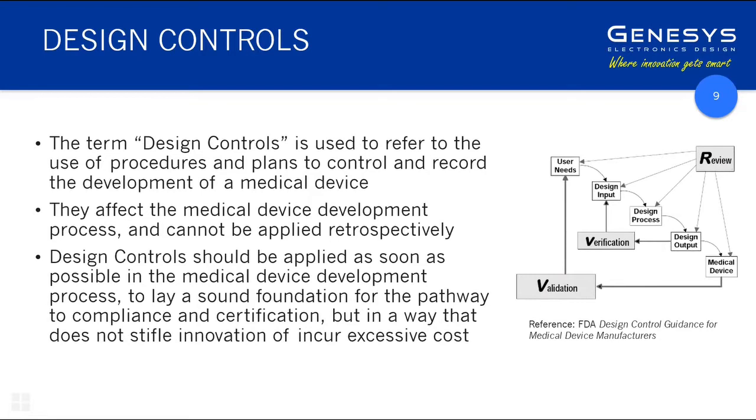So anyone who tries to do so will find themselves in a world of pain. One of the things, when I was listening to you then, the impression I got, particularly when you thought about, oops, you might have left something out of the user needs or it didn't get translated properly, is the need for absolute rigor. I've seen these kinds of workshops in action and they can be quite painful in the level of detail they go into, looking at something from 10 different angles to make sure you've left nothing out. But I guess the regulatory requirements are all trying to enforce what they know from best practice needs to be done. Absolutely, and you strive at every point to do things as well as you can at that time.